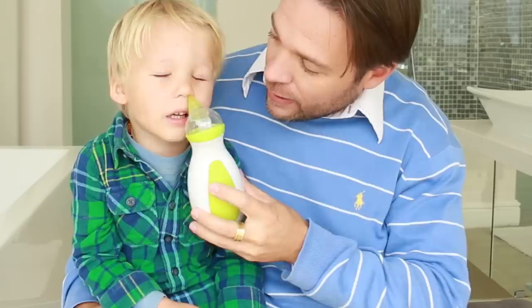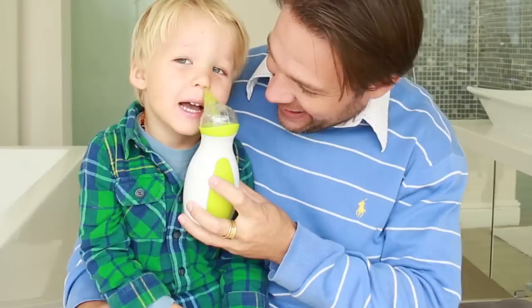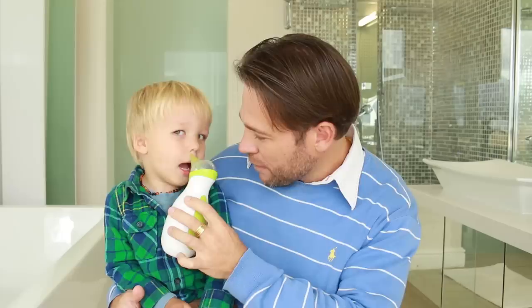Parents out there know how hard it can be to clean a little baby or toddler's nose. JP hasn't been feeling very well the last few days and I've been using this to help him feel a lot better. Okay JP, should we try it out? It's a tickle! Is it funny? Tickle, tickle, tickle! Wow, look at all that stuff inside there — you're cleaning them out! Good boy, now you feel a lot better, JP.